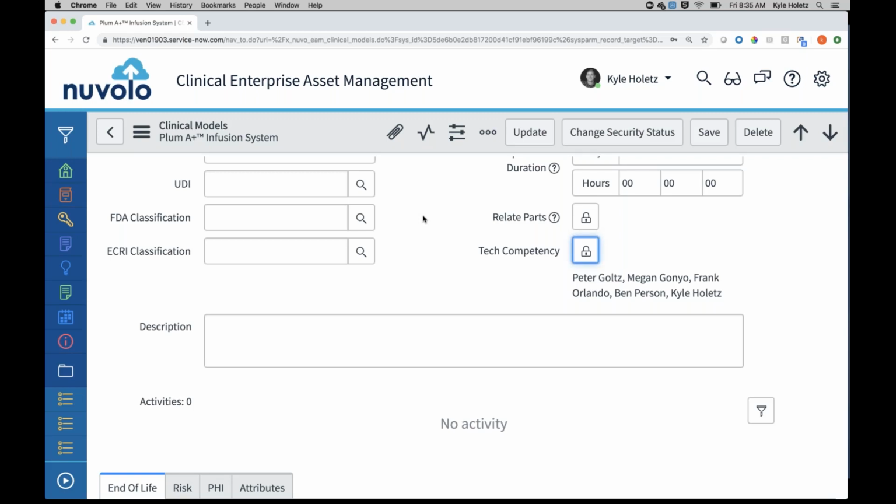If we look at the service history on that asset, we can see that right away there was another work order open against the same device, and someone else performed the work. Maybe that was actually not performed correctly, to your point.